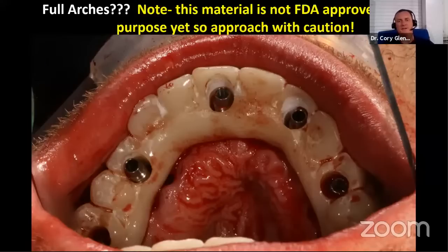And all you've got to do is just rinse and dry this and then squirt some acrylic or dual cure composite to join the cylinders to the temporary. And that gives you an immediate load prosthesis. Way, way stronger than converting a denture, because you haven't ground out tons of material that you have to patch back together. So I think that's a big part of why these are holding up so well.